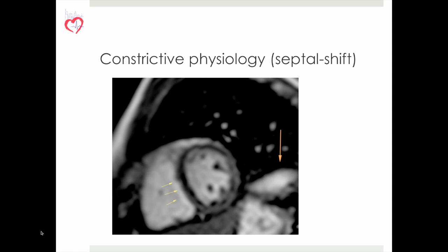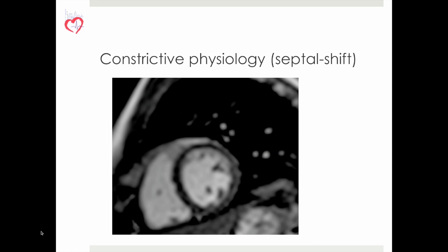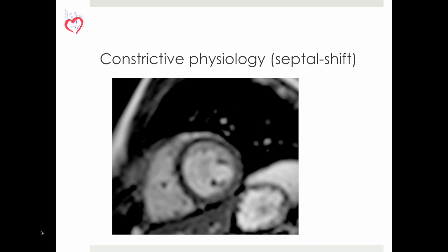Together with a septal flattening with inspiration, this may indicate increased right ventricular pressures and constrictive physiology.